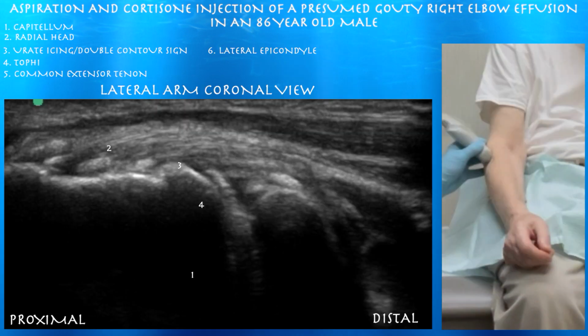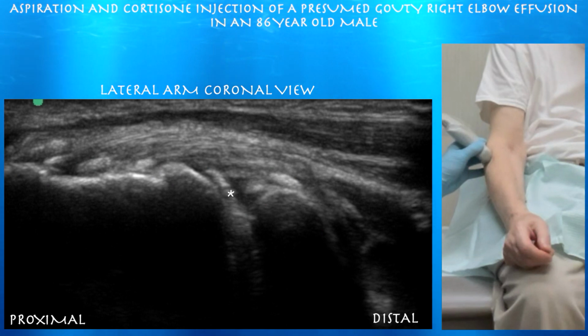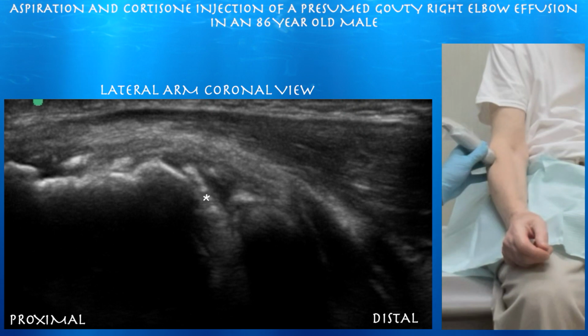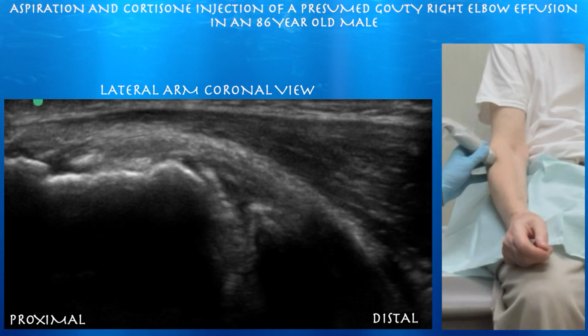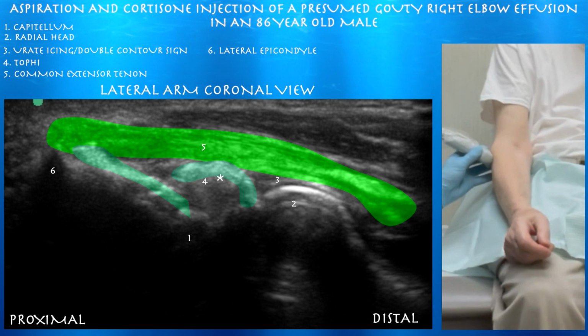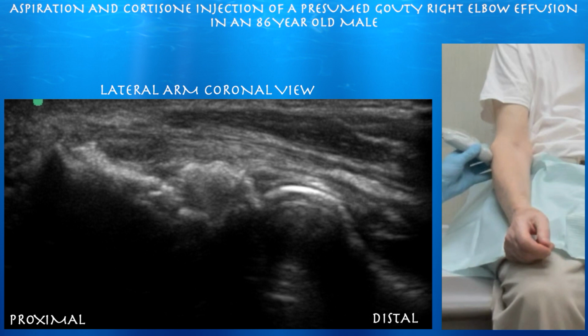Here we're now looking at the lateral elbow. You can see scattered tophi within and underneath the common extensor tendon, and a double contour sign over the capitellum, which is pretty specific for gout. Here you can see that urate icing or double contour sign again. So he has maybe a calcified tophus there just under the common extensor tendon, kind of in the radial collateral ligament.